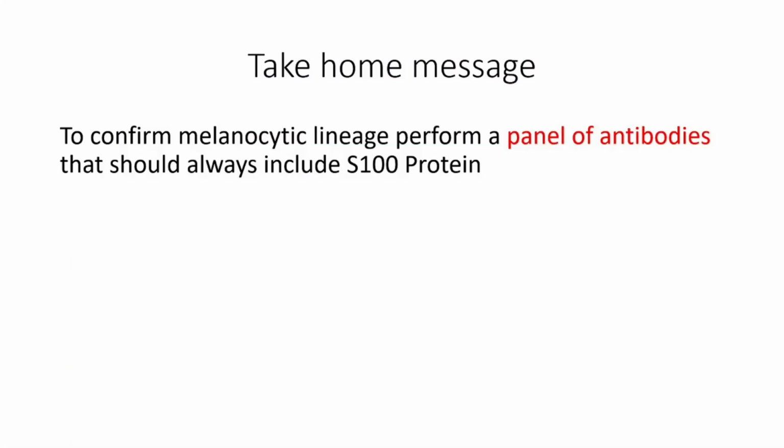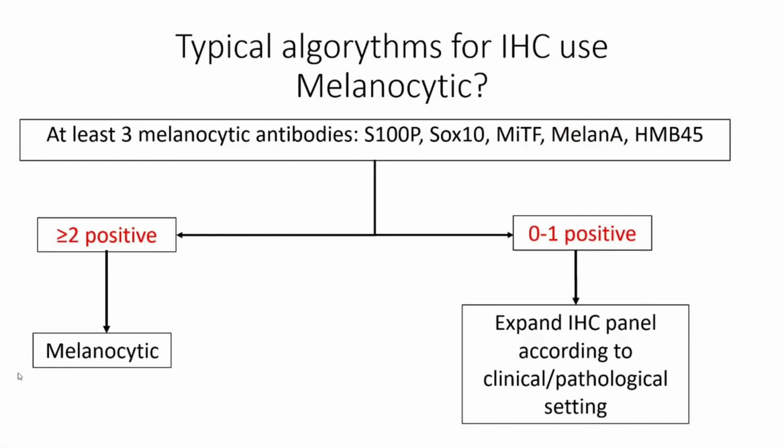Here is my unique take-home message from this video. And here's a small algorithm.